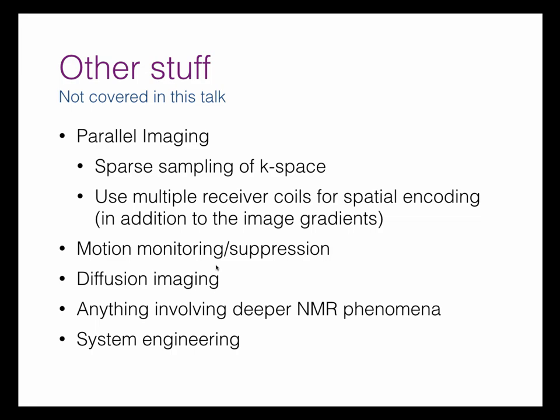So there are some methods which involve using MR navigators that acquire additional data. In addition to the imaging data, they acquire some data which provides information about the subject motion directly, or about the orientation of the object at a given time.